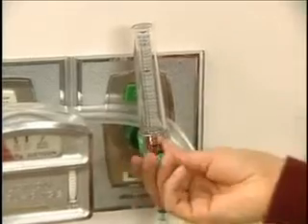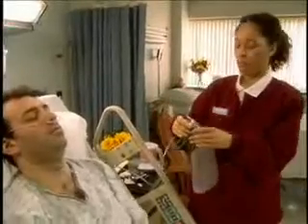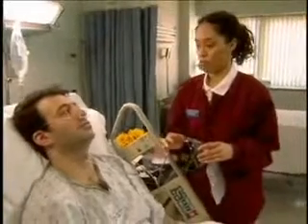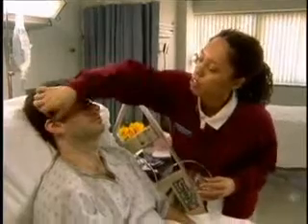Once you've adjusted the flow rate to the ordered amount, be sure to let the bag fill up with oxygen prior to placing the mask on the patient. Right, of course. All right. Okay, I'm going to put the mask on you now, Mr. Simon. Okay? We're just going to take these out.